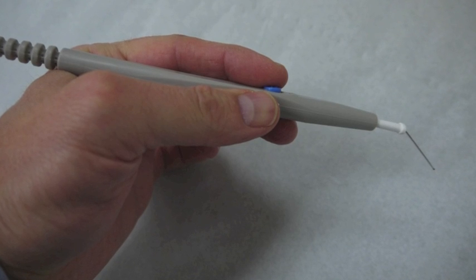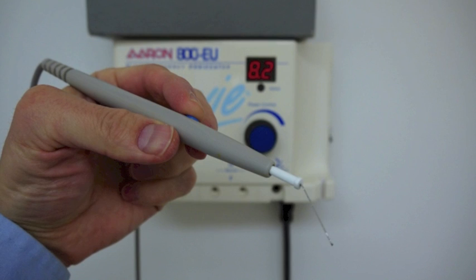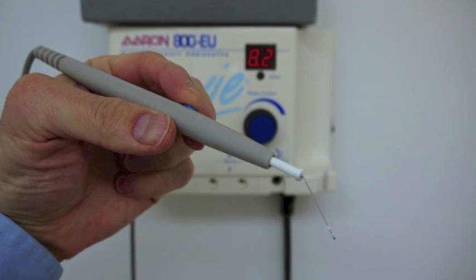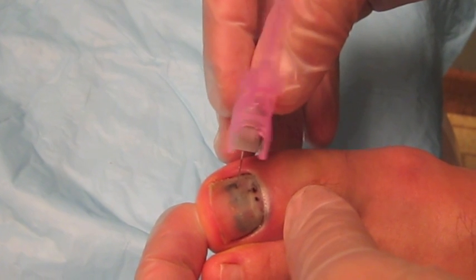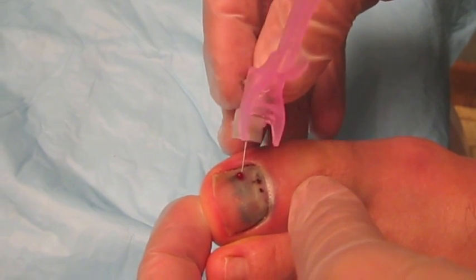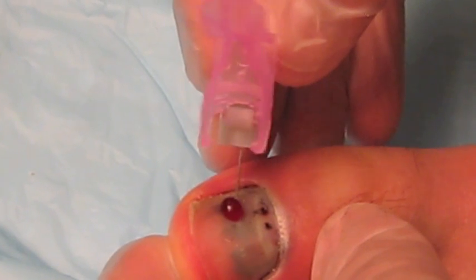When using electrocautery, the procedure of melting a hole is similar to when using a paper clip, but some patients may find it more painful. When using a needle, twirl the needle while exerting pressure against the nail until the blood starts to drain.